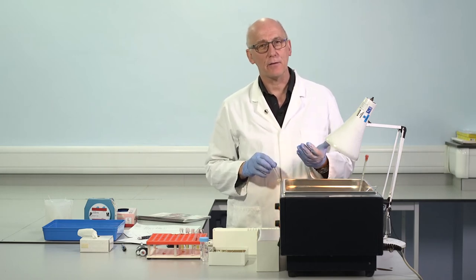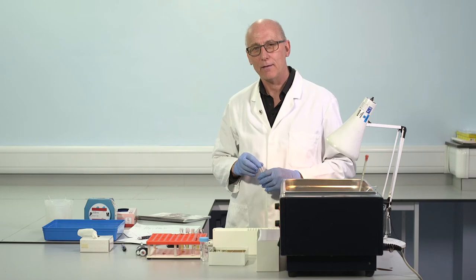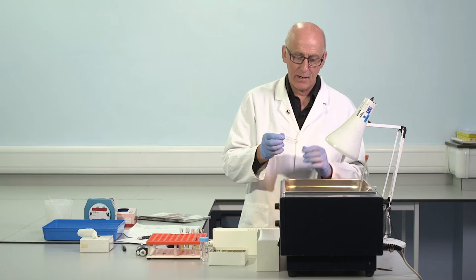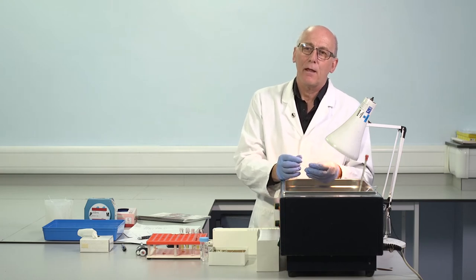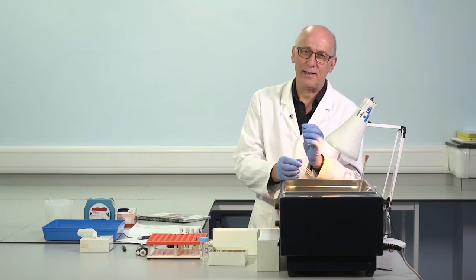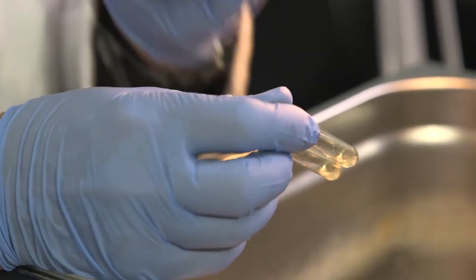The difference between replicates typically increases as the time is longer, but of course that's less impact on the decision we'll make. It's a grossly prolonged APTT that we're dealing with. So I come back to the endpoint. It's spread out over 3 or 4 seconds at this level. And I think the important thing is to be consistent, but again, it's not so important if we call it the beginning or the end of that process. I think in practice, commonly in my centre, we use the first changes that are clearly a clot forming. But again, I think it's not such a big issue.